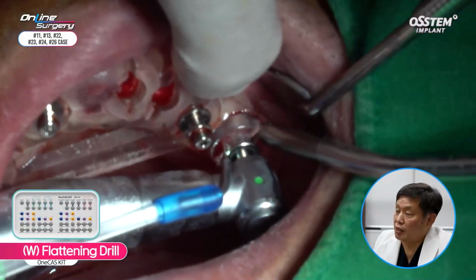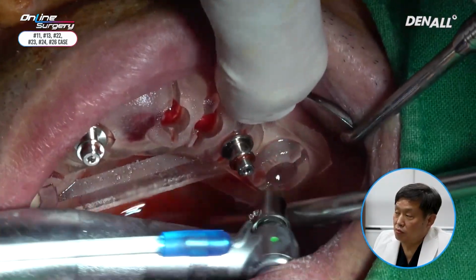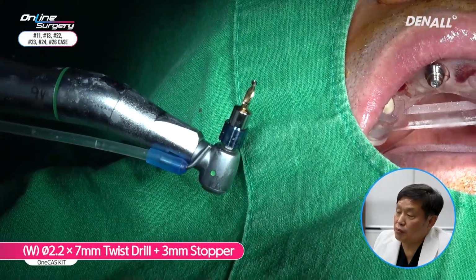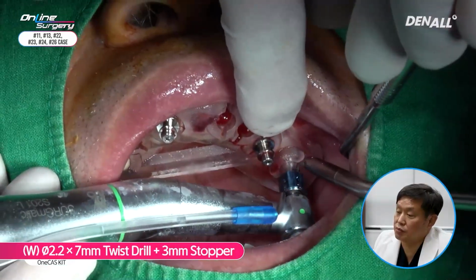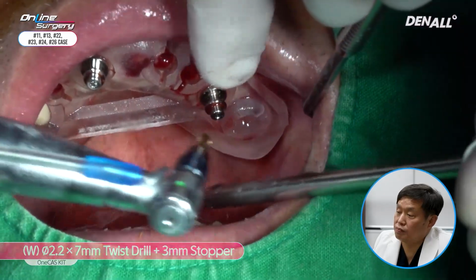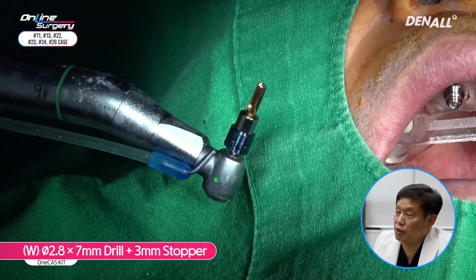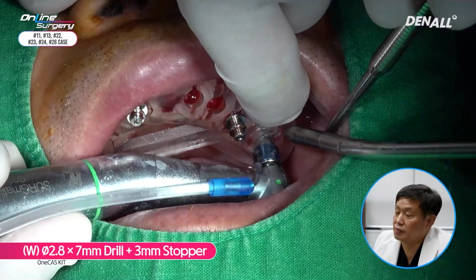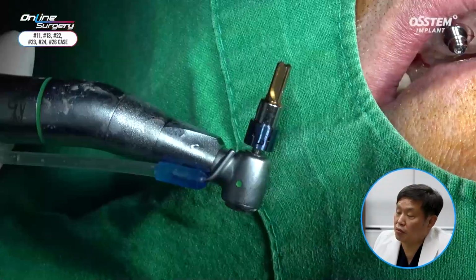Moving on to number 26. The flattening drill with gold rim was used to do flattening. A 3 millimeter stopper was used because it was assumed to be 5 millimeter. A 2.2 twisted drill with a 3 millimeter stopper was used to drill 4 millimeters, followed by 2.8 by 7 millimeter with a 3 millimeter stopper. In other words, a 4 millimeter drilling was done. 2.8 with 3 millimeter stopper.